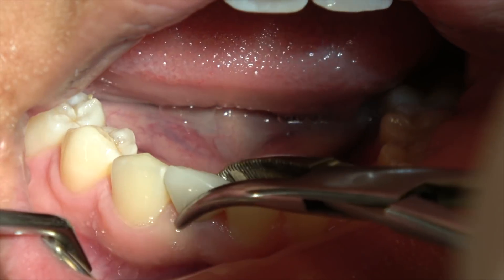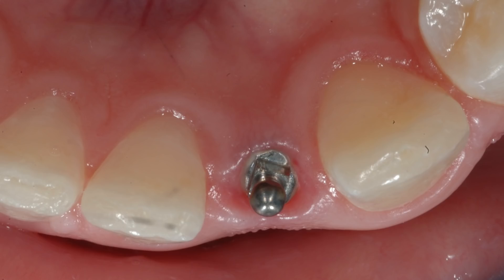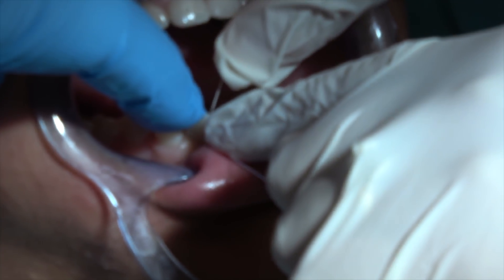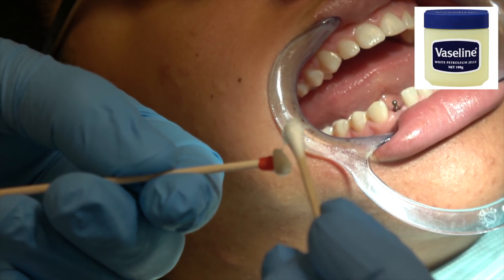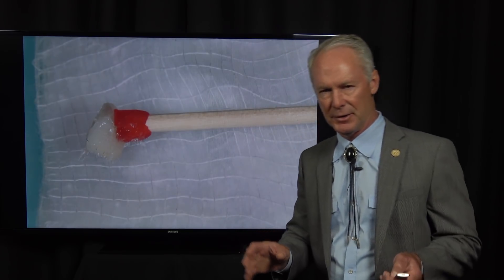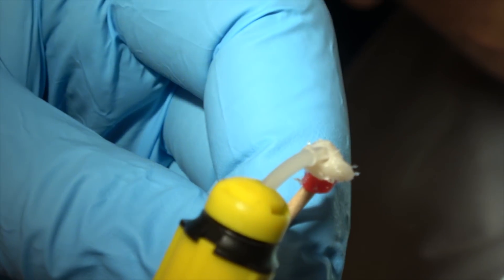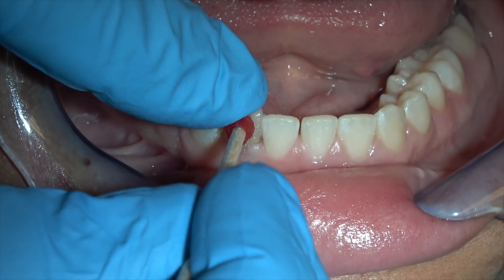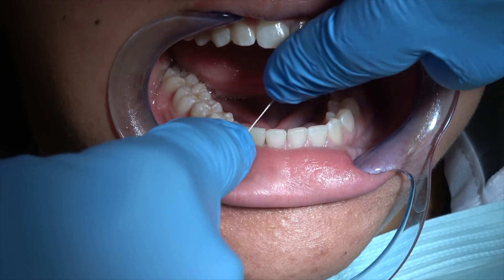There's the crown — remove the provisional; it just snaps to place. You can see the shelf is just barely subgingival. I put Vaseline all over the crown, even at the margins all the way around, because you don't want any provisional cement trapped at the margins — that can be a fatal flaw and cause loss of the implant. So just a little bit of cement just around the margins; don't fill it up. Push that to place. Pop the contacts, but don't remove the excess cement until it has initial set.